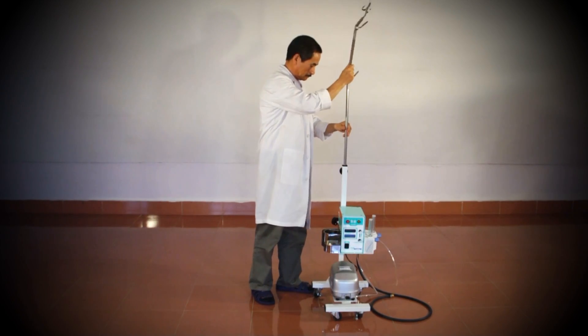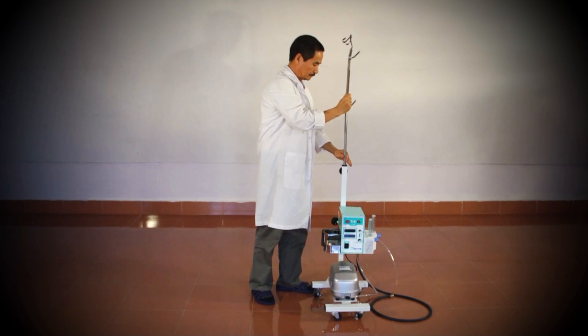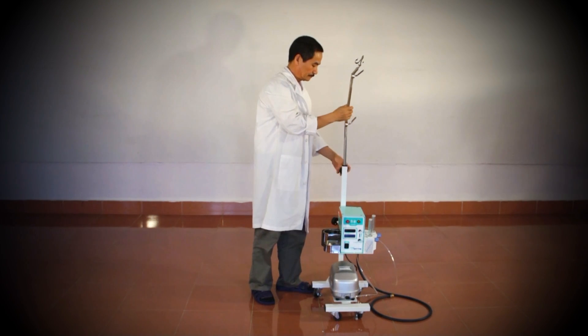Next, insert the CPAP arm into the main unit and secure it by tightening the black knob.